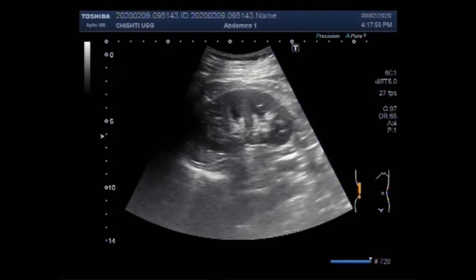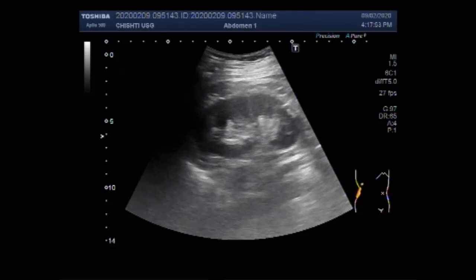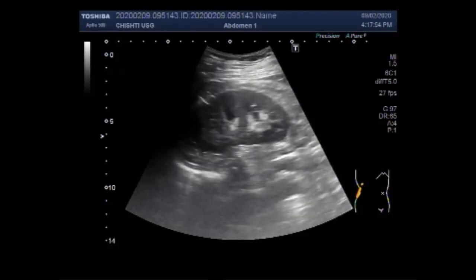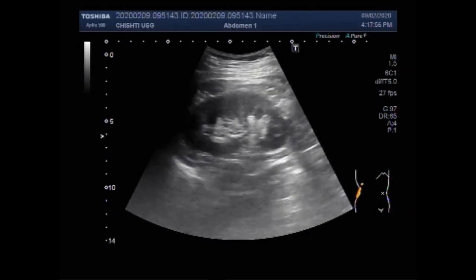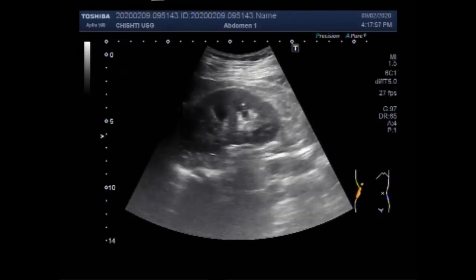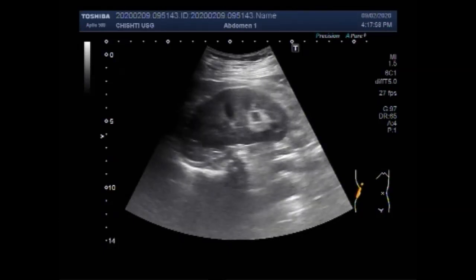Dear viewers, I hope you are all fine. This ultrasound video shows a large vesicle growth.